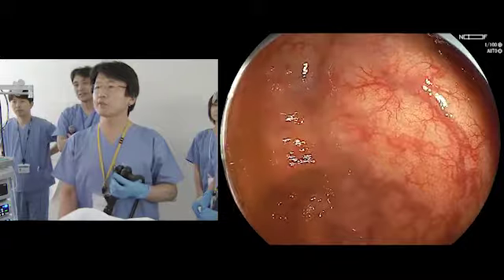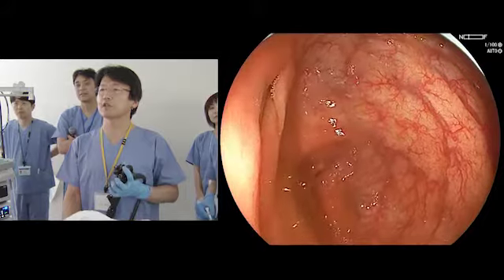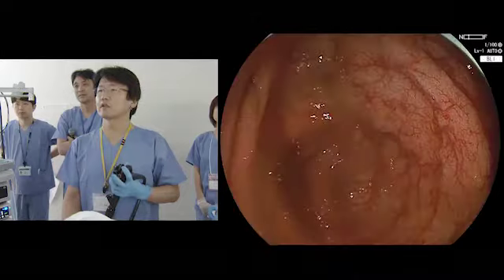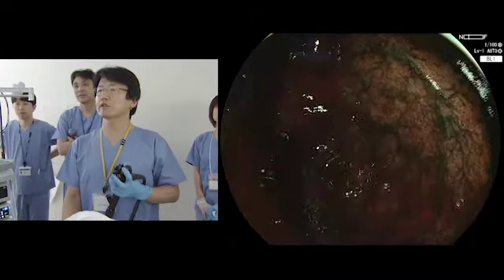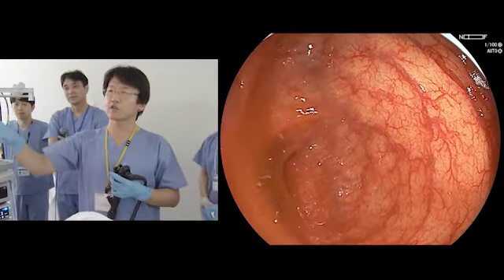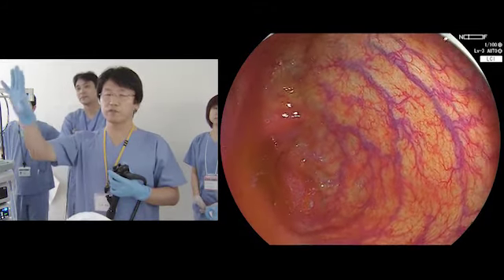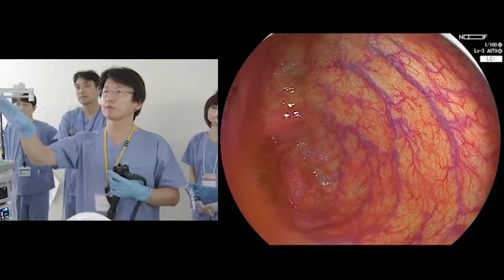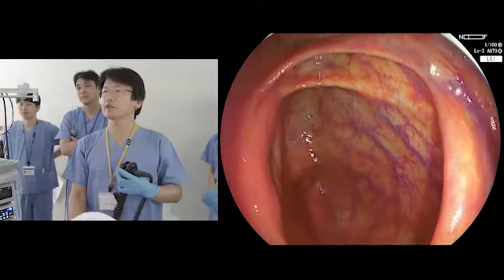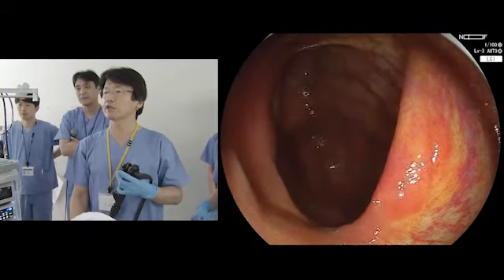This is the white light image, and recently I start the observation from the LCI. You see, this is the LCI, and this is the white light. With the white light image, almost everything is orange-like color, but using LCI, deep vessel becomes purple, and mucosa becomes yellowish, and neoplastic lesion becomes reddish. So it becomes much easier to detect lesions.